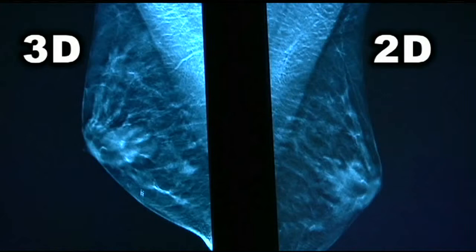But what that does is give the radiologists numerous images to scroll through. They can tell if overlapping breast structure is really just overlapping or if something's brewing inside the breast. The three-dimensional mammography allows them to really peel those layers away and see in and around and within the breast structure itself. And I can only imagine that it would make women feel so much less anxious, and doctors too for that matter, because they feel better coming out of it. They know that there's a higher percentage chance that something will get caught.